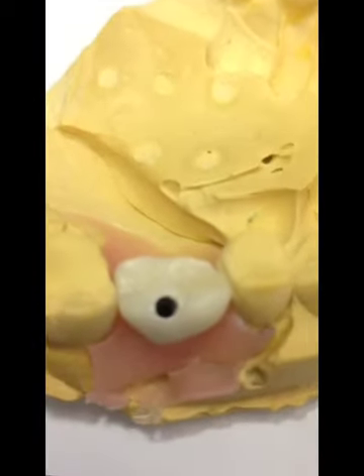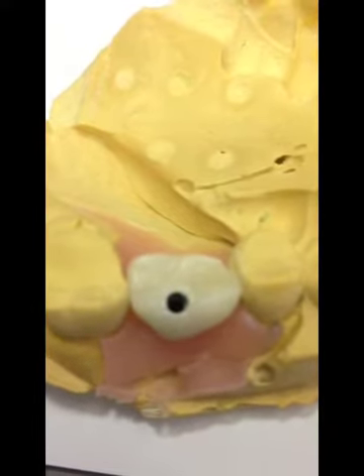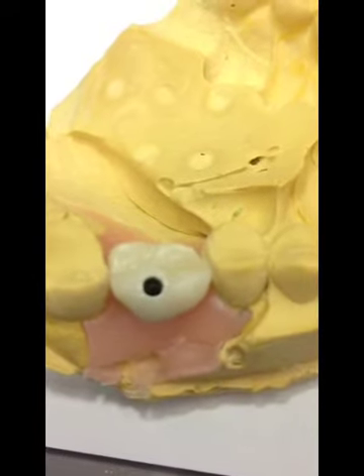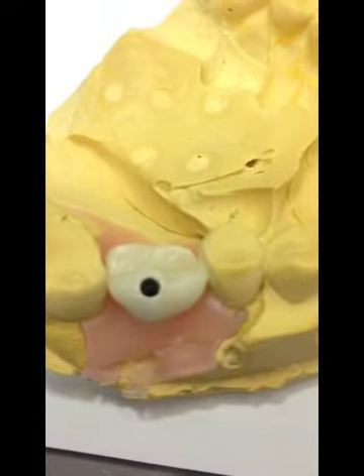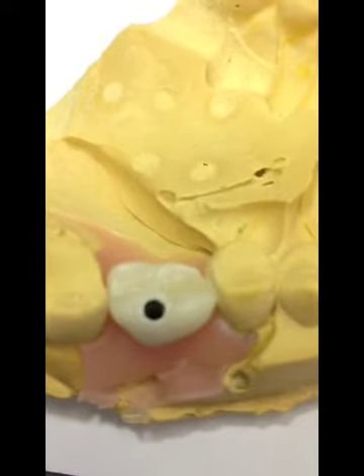Make sure to take the screw out, because if you get any cement down in this hole, it's not that hard to clean it out unless you have a screw in there. And then it's impossible to clean it out, and you've got to buy a new abutment and redo the whole thing. So we don't want to do that. Make sure to take the screw completely out of the abutment.